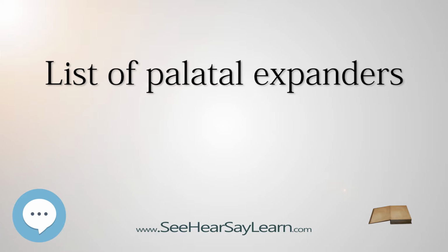It is important to know that information here may be outdated within 5-10 years as new RCTs, systematic reviews and meta-analyses will be done and they may produce different results than what are stated below. Tissue vs. tooth-borne expansion. In 2005 Garib et al. stated in their study that tooth-borne, Hyrax, and tooth-tissue-borne, Haas type, expanders tended to produce similar orthopedic effects.